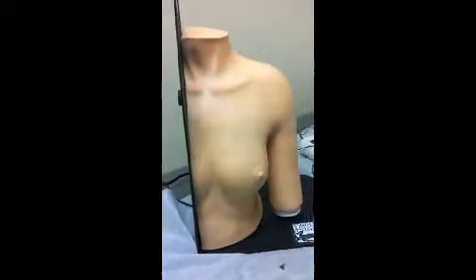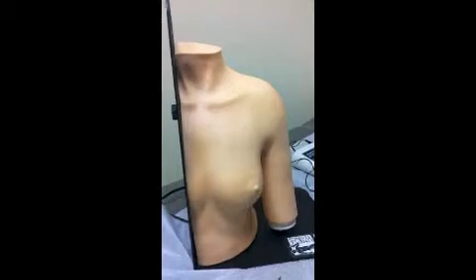While we're here, I would like to identify the landmarks that we use for the joint injection. So feeling here for this prominent process is the acromion process, the head of the humerus, and then the coracoid process, which is the major landmark for this procedure when we use the anterior approach.